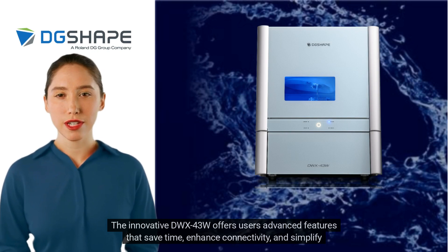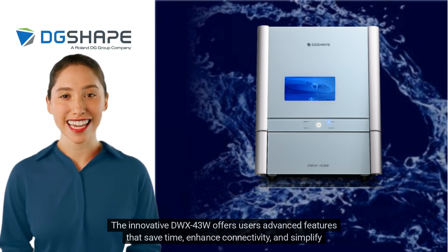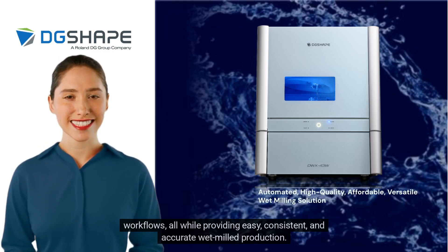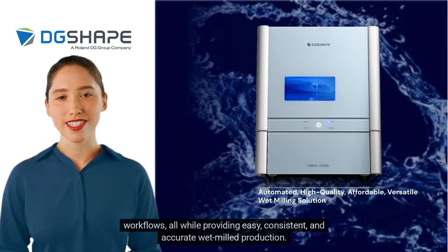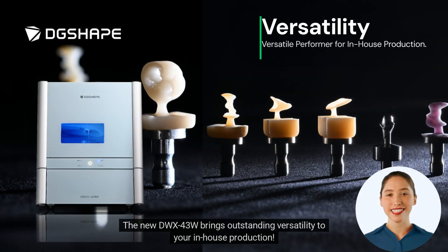The innovative DWX43W offers users advanced features that save time, enhance connectivity, and simplify workflows, all while providing easy, consistent, and accurate wet-milled production. The new DWX43W brings outstanding versatility to your in-house production.